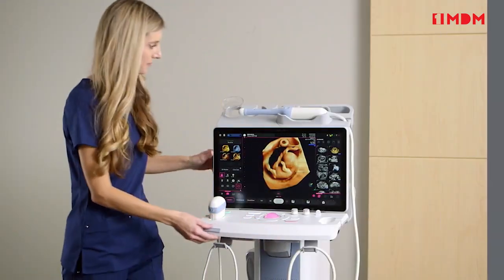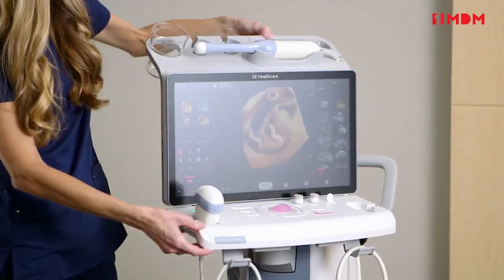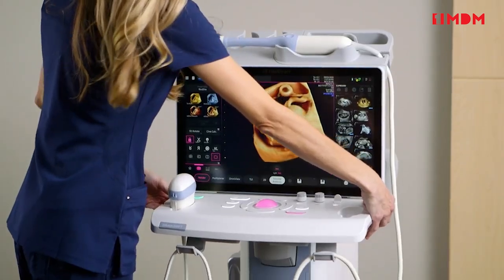The system provides a wide range of ergonomic positions, including touch monitor tilt, user interface rotation, and height adjustment.